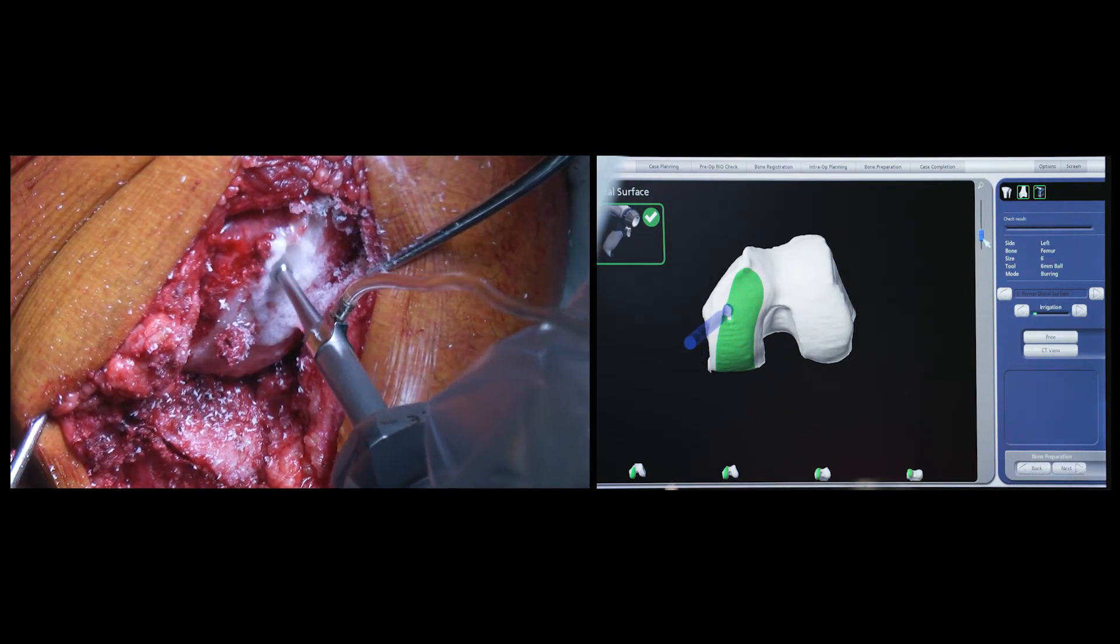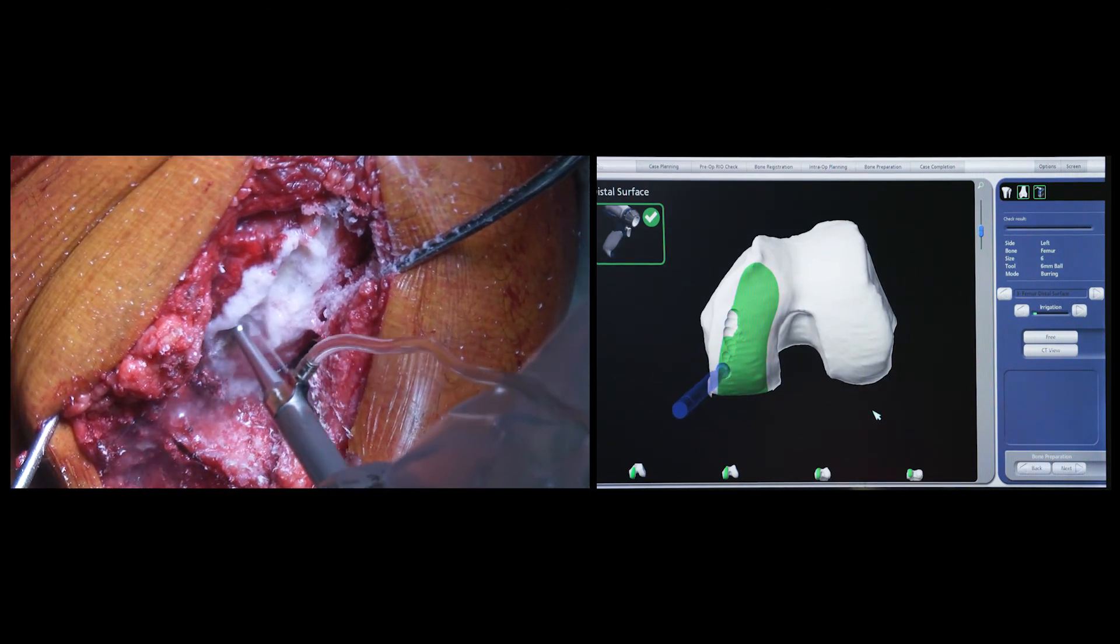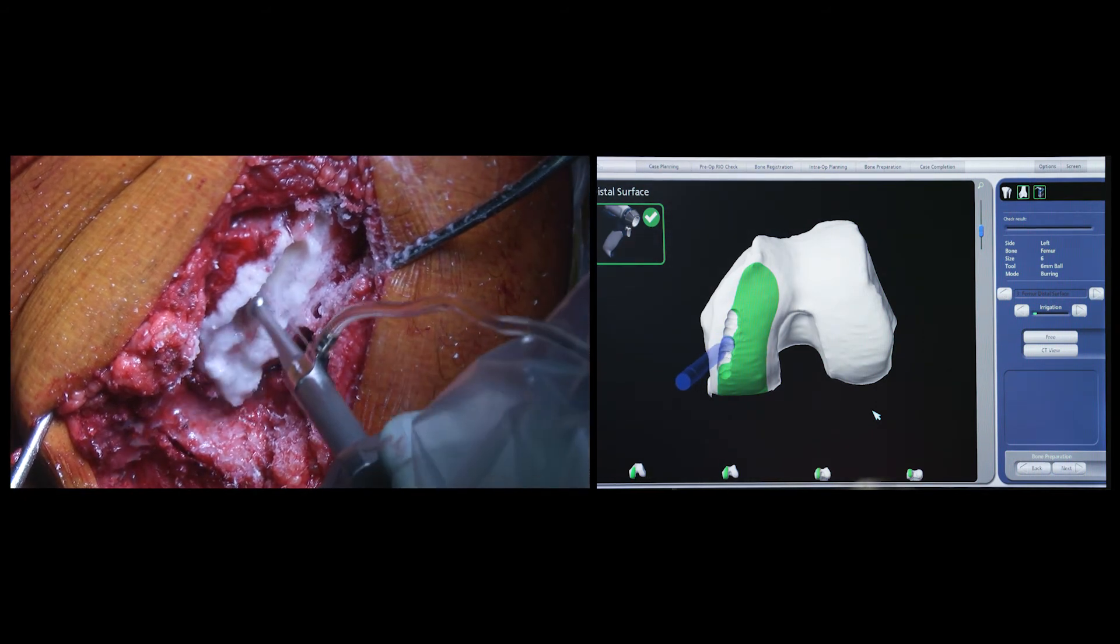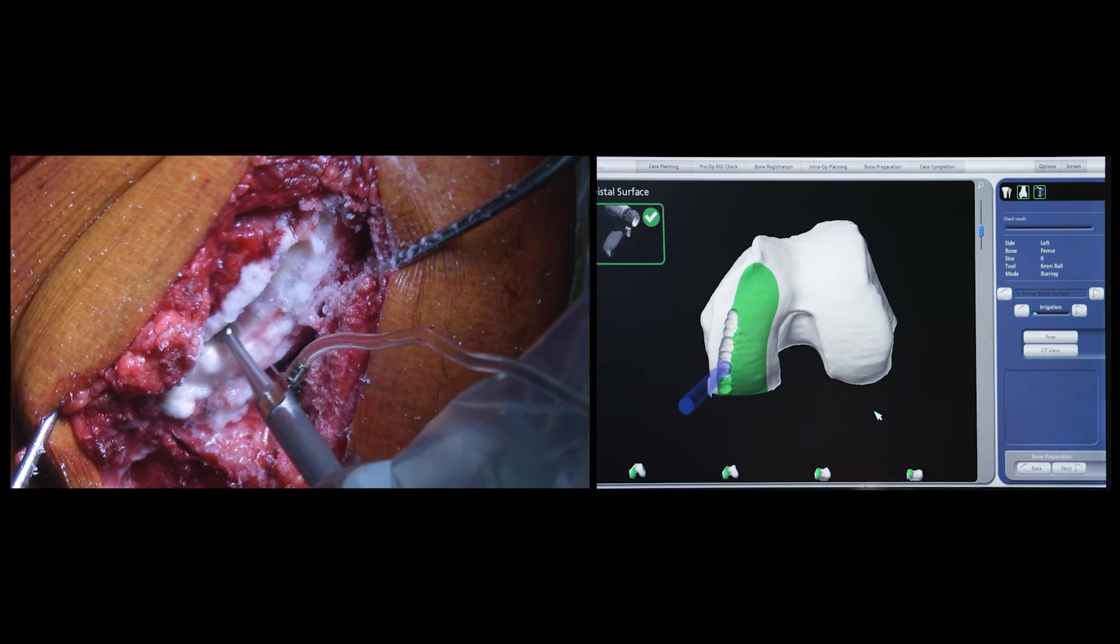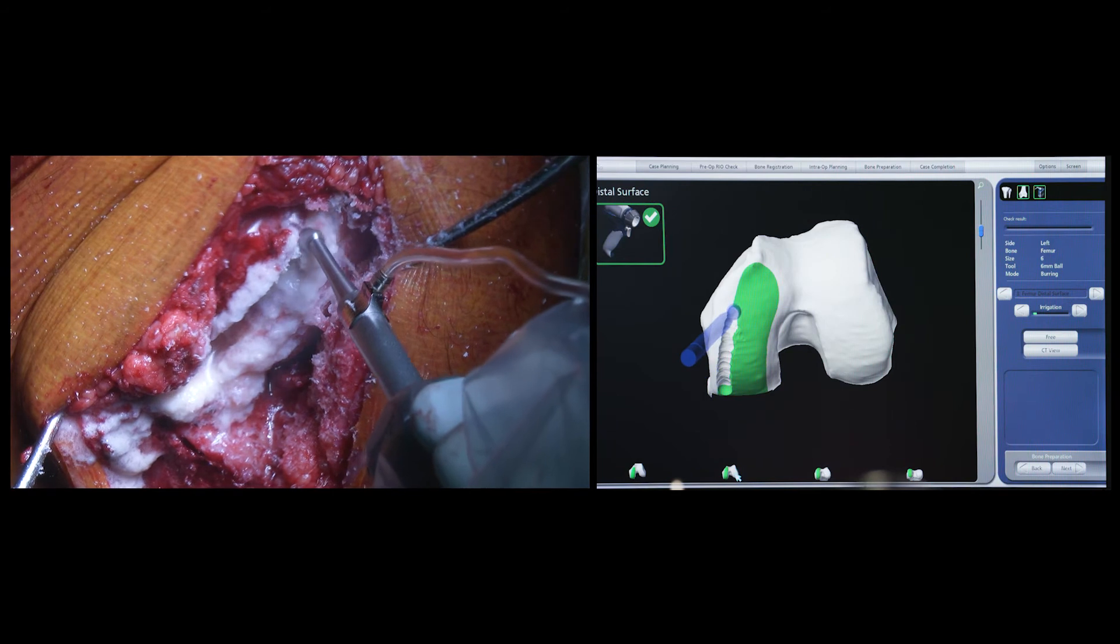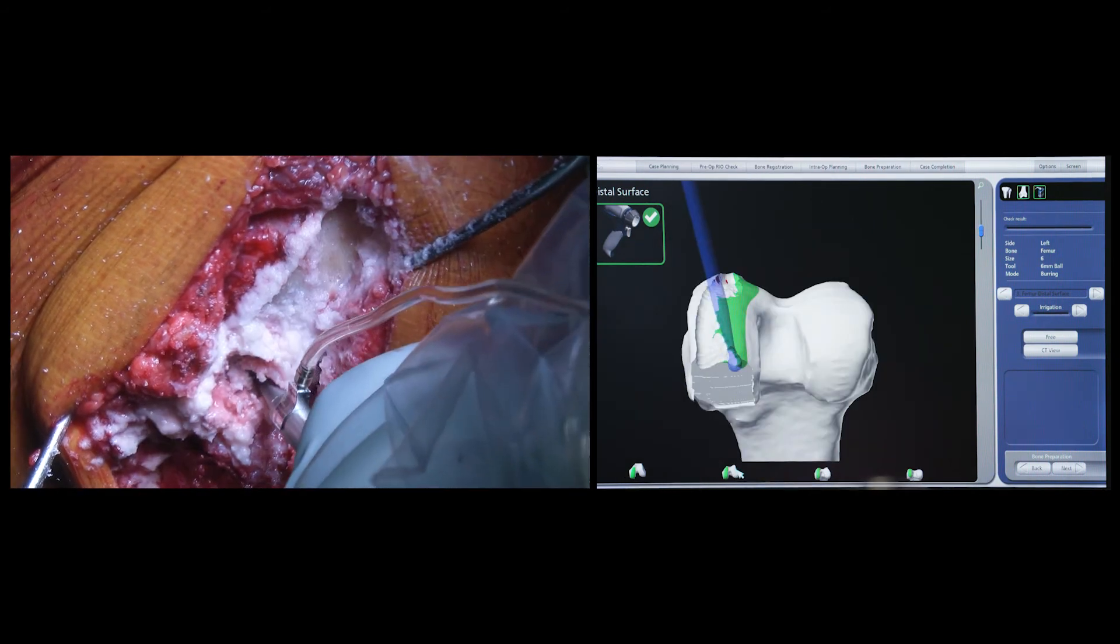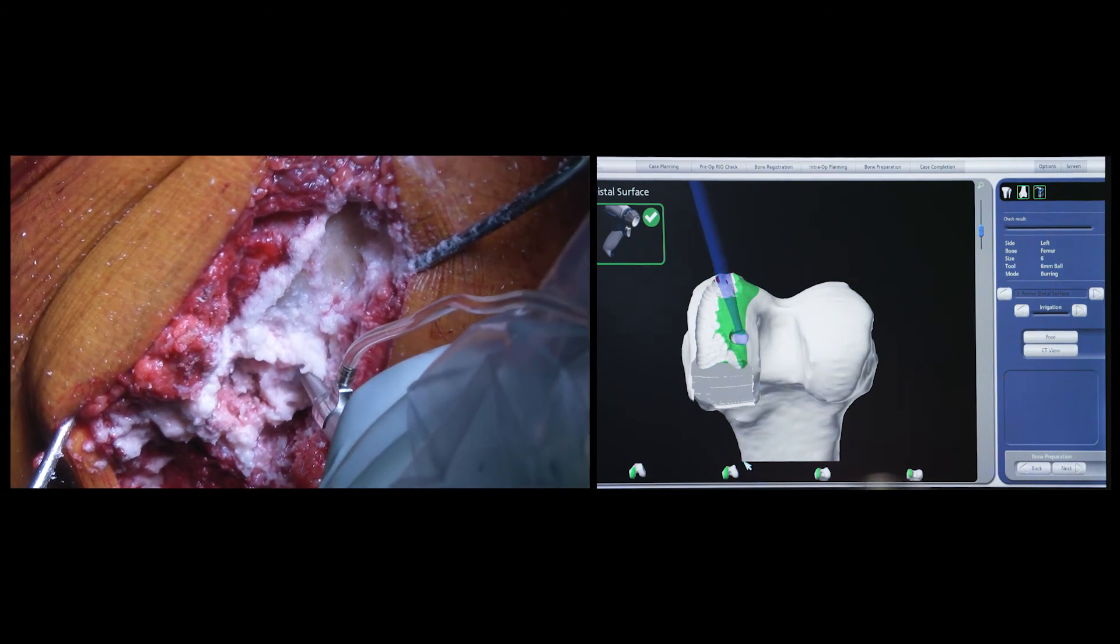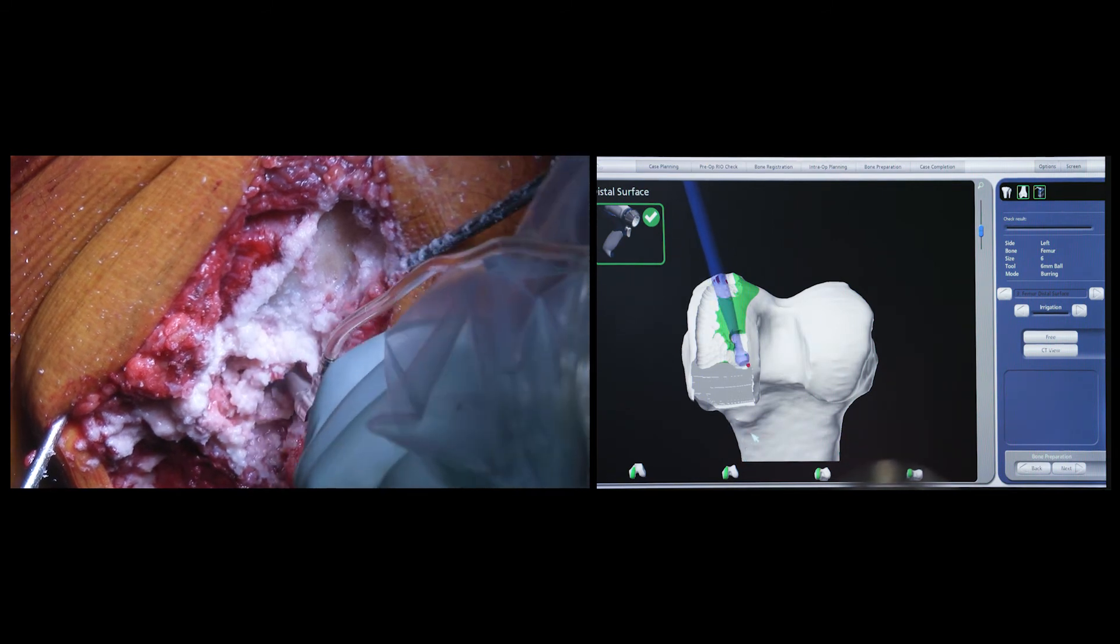The proximal tibial cut and the posterior condylar bone are cut using a saw, and as eventually you'll see, the distal femoral bone is removed using a high-speed burr. The advantage of a burr is that because of its small size, it is able to safely remove all the bone all the while minimizing damage to the surrounding soft tissue structures, potentially reducing post-operative bleeding and pain.